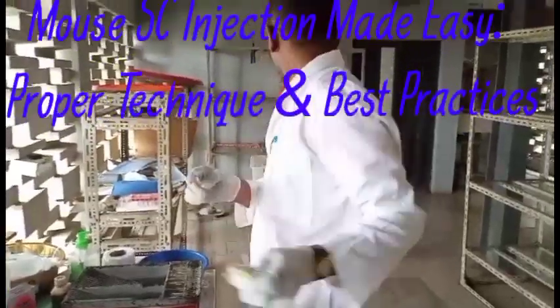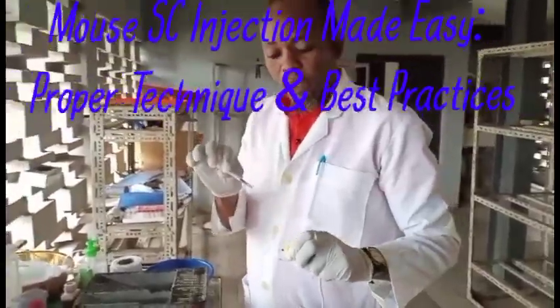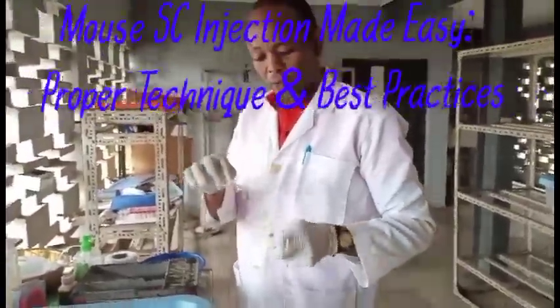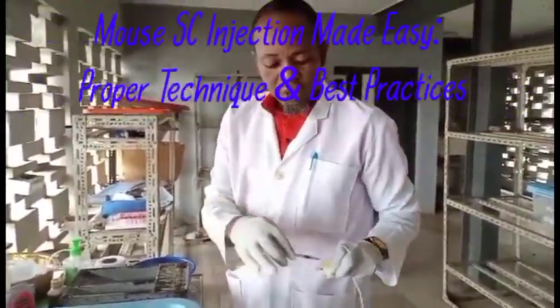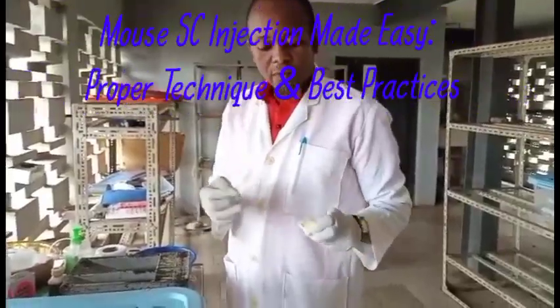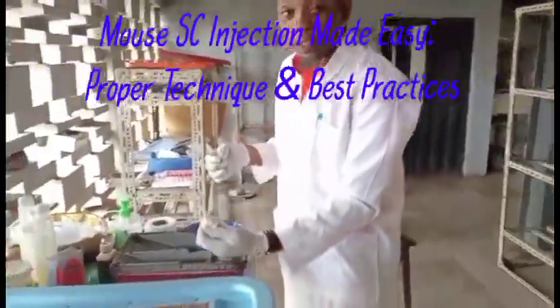Once you handle the mouse for subcutaneous injection and you want to administer treatment, you can use the flank, both sides, any of the sides here, or you use here where you do the tenting.